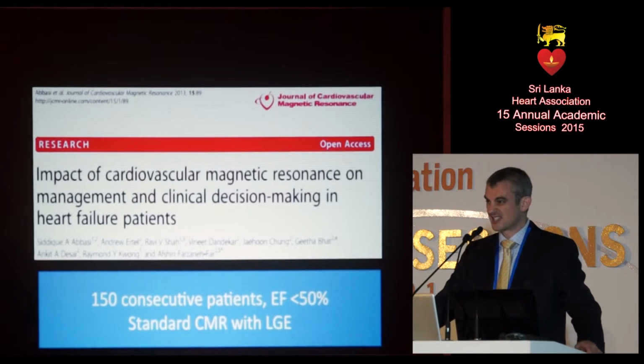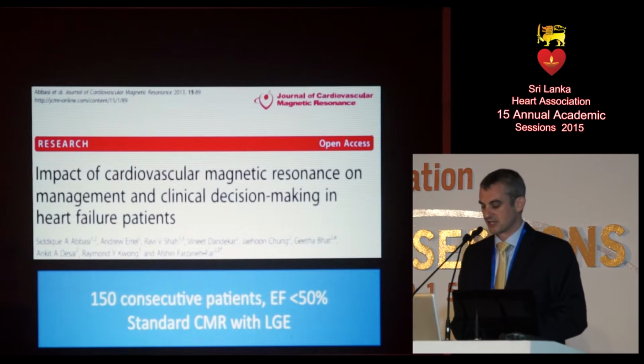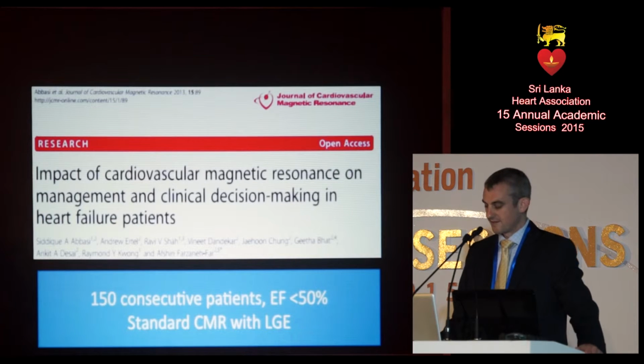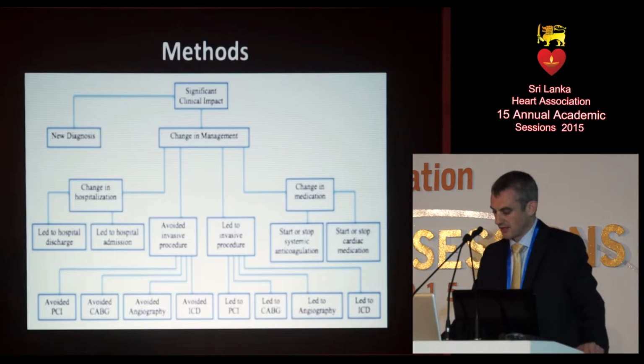They just did a standard MRI scan, so they just looked at function and scar. There was no perfusion imaging, no coronary angiography done in these patients. And I'll show you a bit more detail about the findings here.